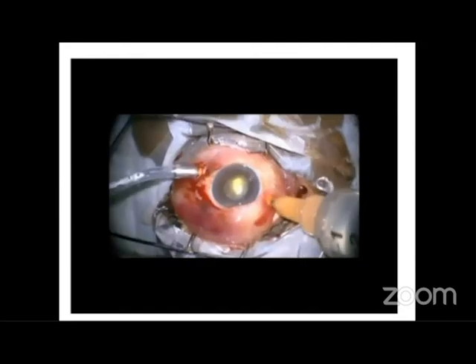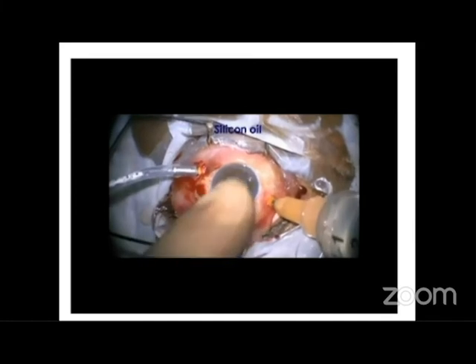The anterior part of the retina is also excised to prevent anterior PVR changes. Endolaser is done to the edge of the retinotomy. Retina is well attached after PFCL gas exchange. Silicone oil is injected.